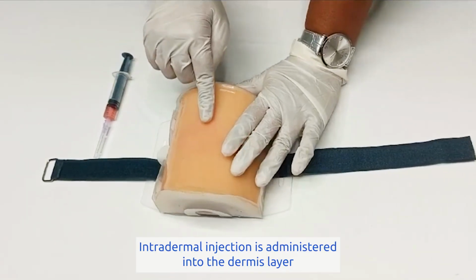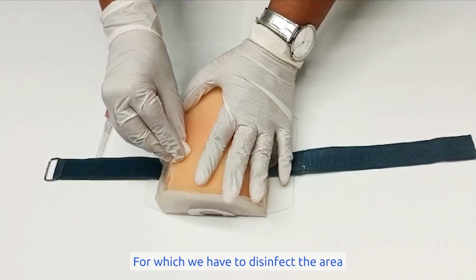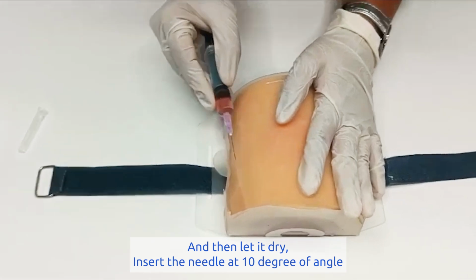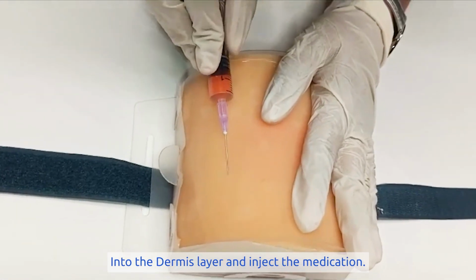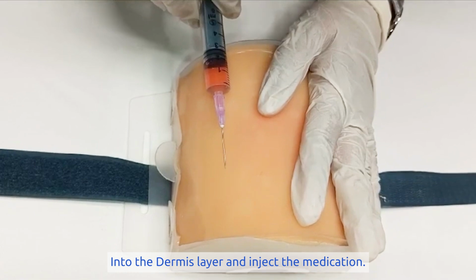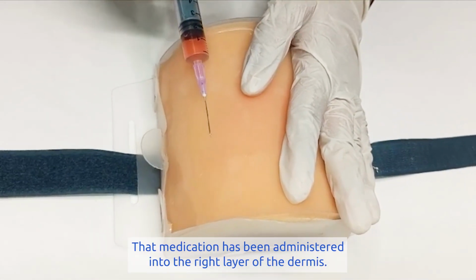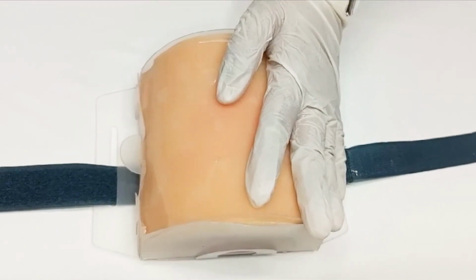Intradermal injection is administered into the dermis layer, for which we have to disinfect the area and then let it dry. Insert the needle at a 10 degree angle into the dermis layer and inject the medication. After this, a bleb will be formed, which indicates that the medication has been administered into the right layer of the dermis.